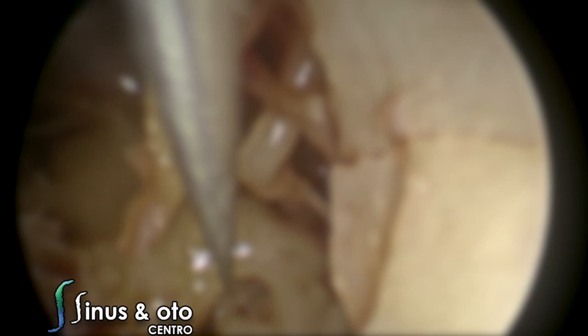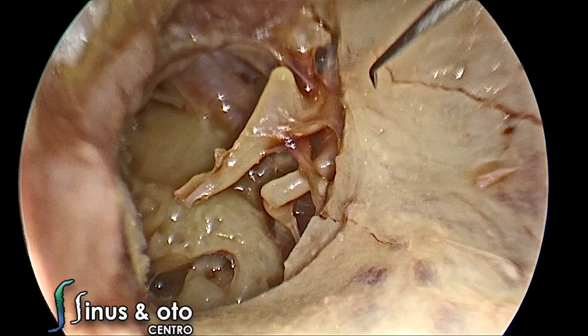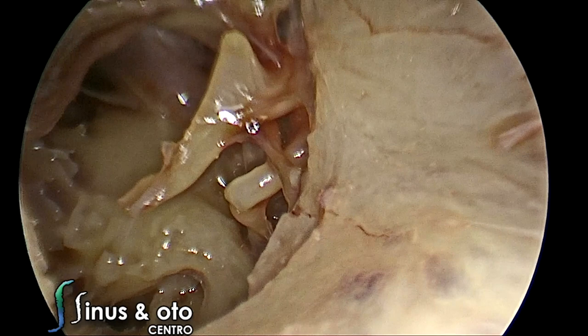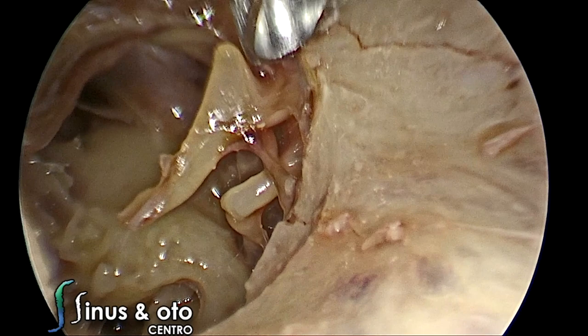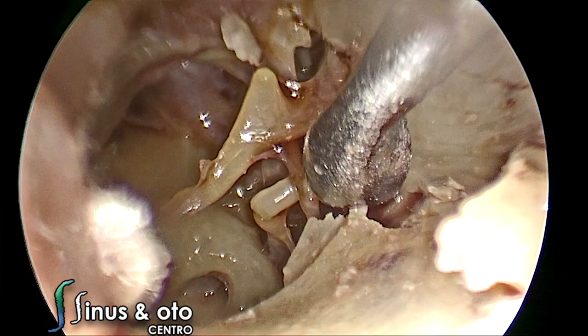Endoscopic surgery has become very popular, especially to treat middle ear pathologies. When you study the anatomy with endoscopes, it provides a better view of the middle ear compared to other instruments. We are now going to curette a little bit to expose the long process of the incus and the facial nerve better. The key to successful curettage is to have a very sharp, good curette — you use the borders of the curette to remove the bone.